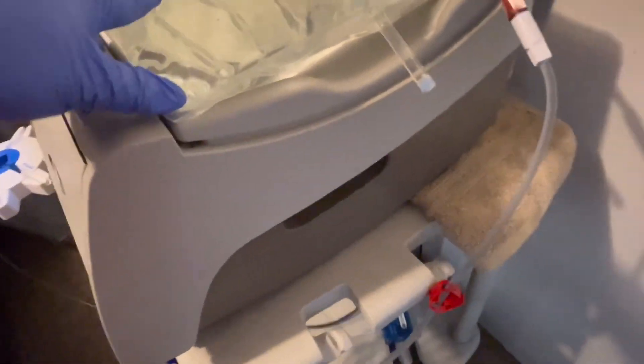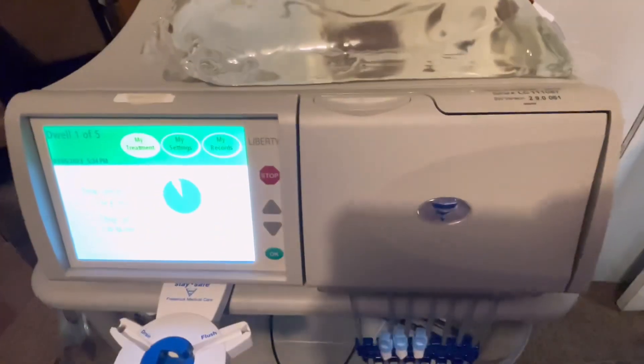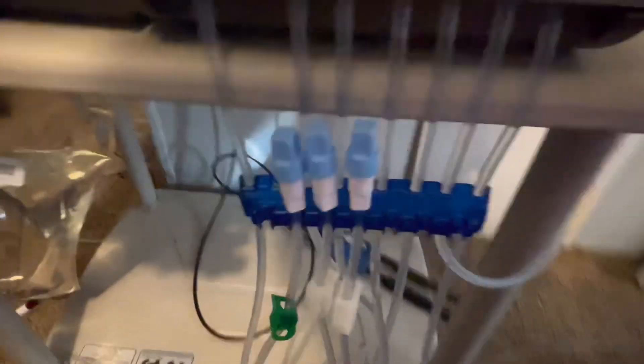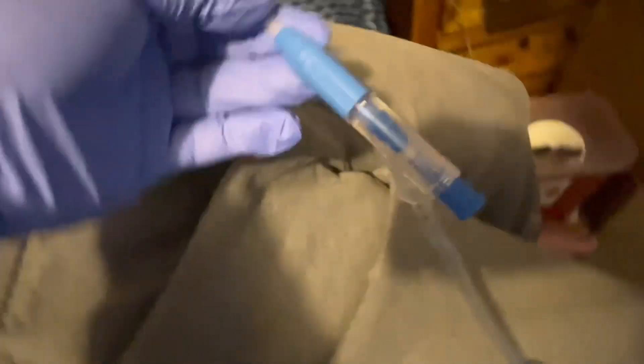So that's how it looks — it's kind of a rectangular machine, but that's the dialysis machine. This line here goes to the patient, and the hose is actually 25 feet long, so that is what's connected to our patient.